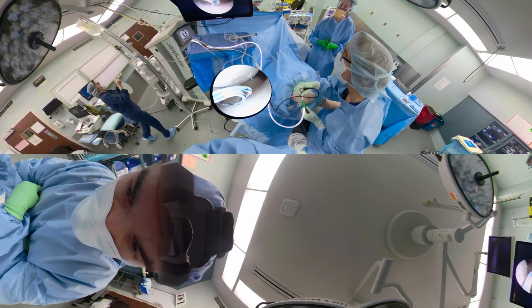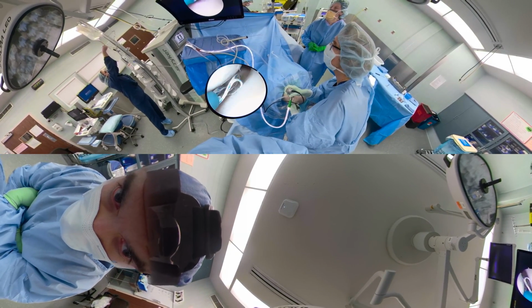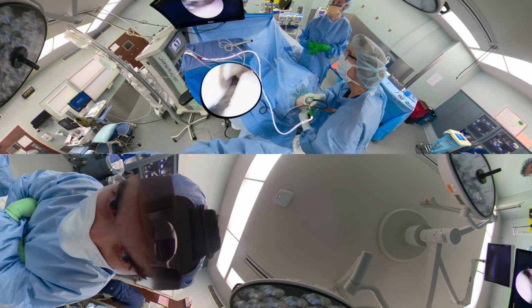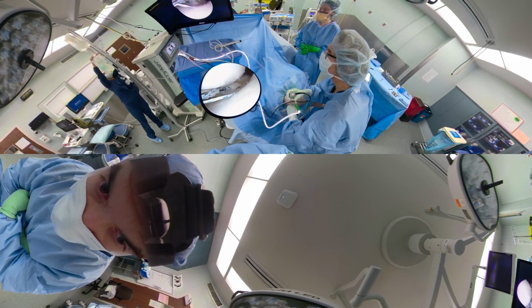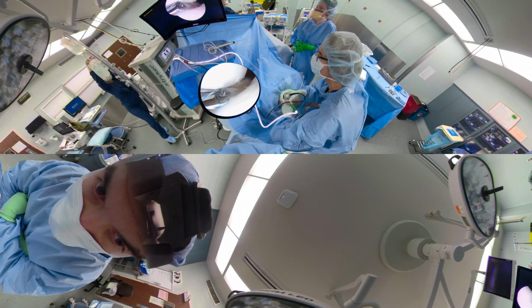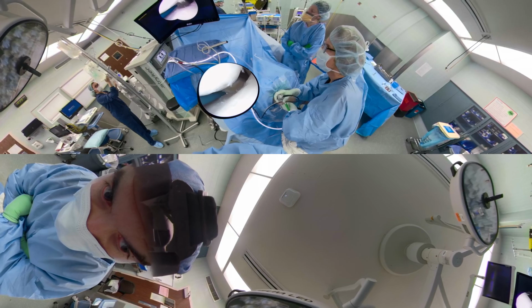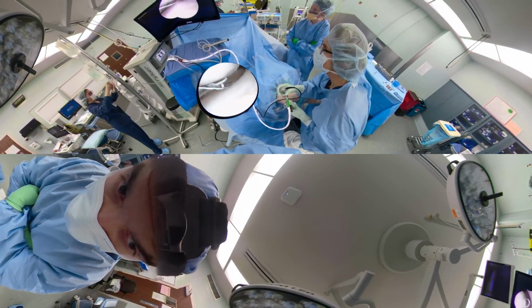So we'll start off on the femoral side, and you want to get your angle and be able to see. Some of this is wiggling it around, trying to get a little better view. So I'll start this out to make sure it's in the portion of the meniscus toward me, and go all the way through the capsule. You'll feel a little pop. This is the first generation of the meniscus repair, Smith & Nephew's Fast Fix.